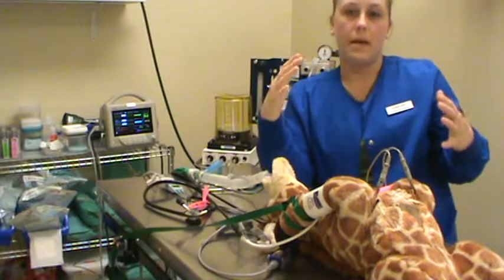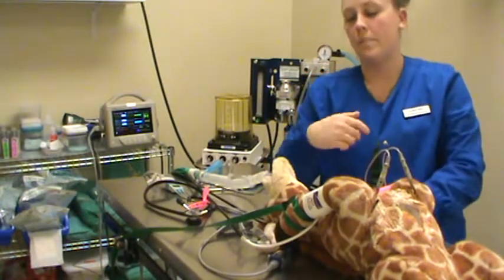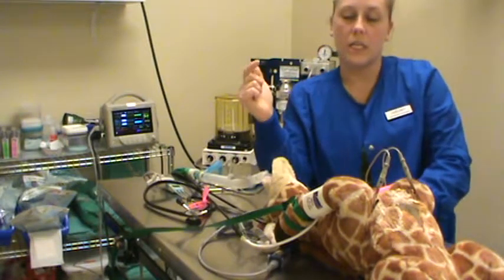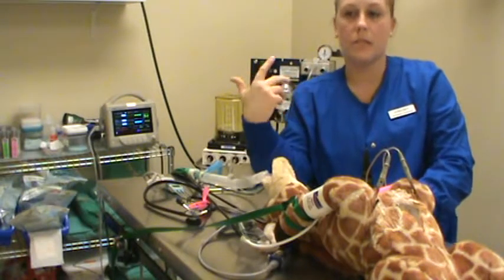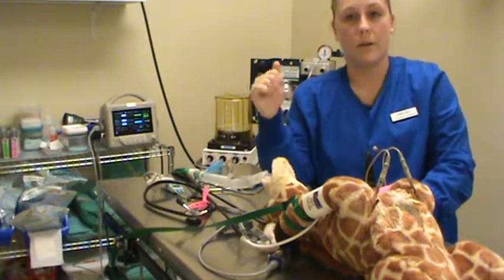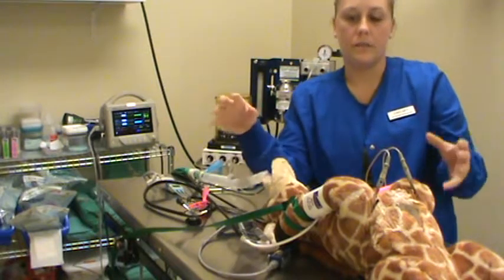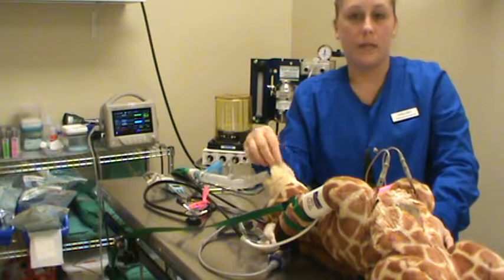You're going to be using your towel or whatever to restrain them on the table, keeping them safe so that you don't get hurt, so they don't get hurt. You're going to see a rise in respiratory rate. They're going to be panting potentially at this point. And you're going to see a higher heart rate and a higher blood pressure, if you're monitoring at that time. So that is your induction stage, where you're just coming into the anesthetic and they're panicking.